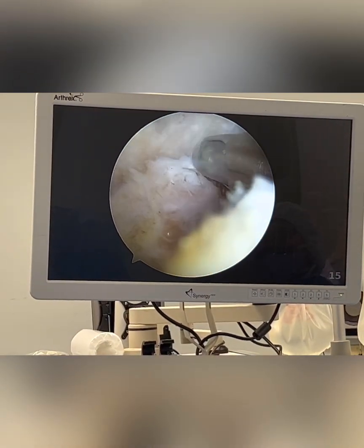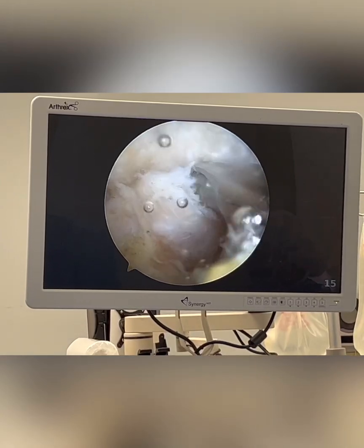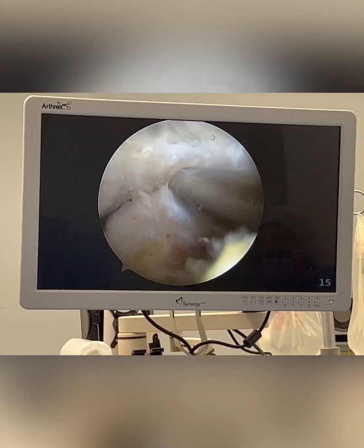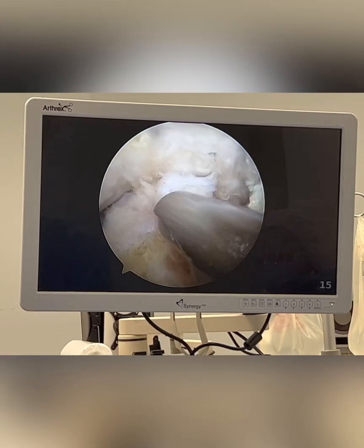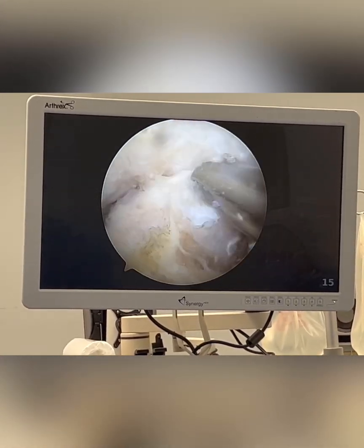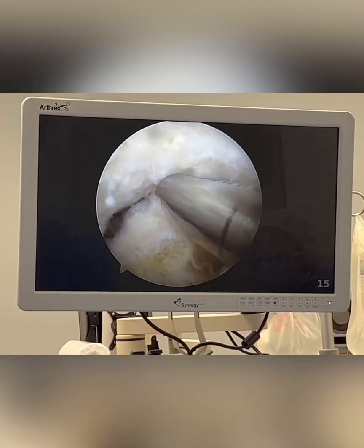And this is going to take care of the patient's elbow pain, which occurs with extension. The patient was also having elbow pain which occurs with flexion. I already did a very similar procedure in the front — removing some spurs, some loose bodies, releasing the capsule. Very similar to the cauliflower elbow surgery I do in mixed martial artists, but in this case not a mixed martial artist.